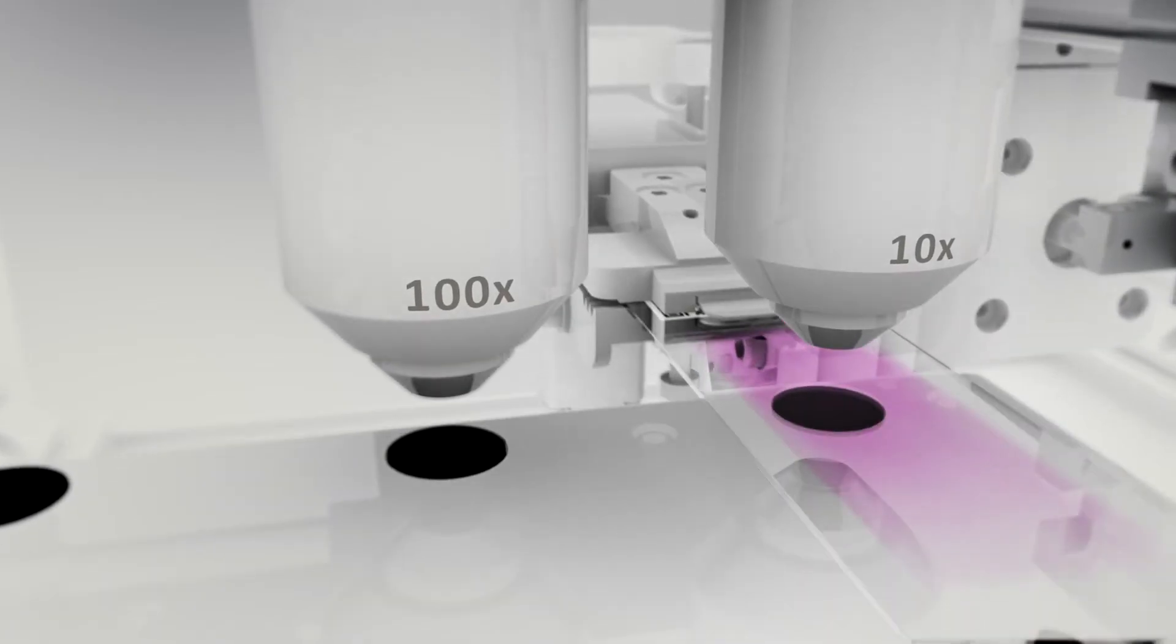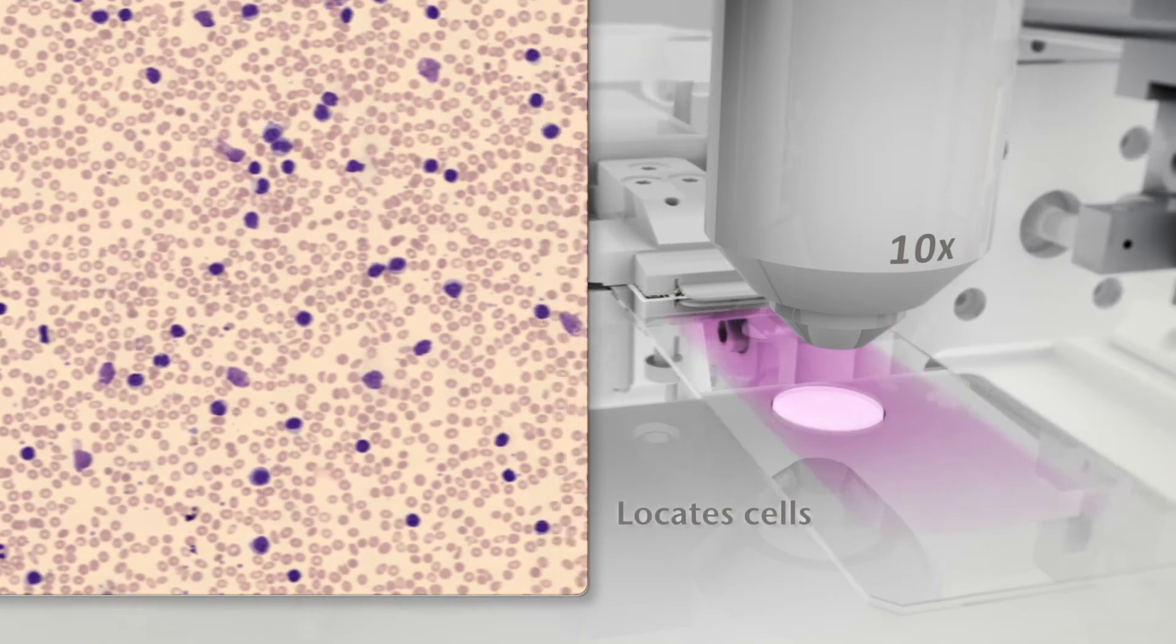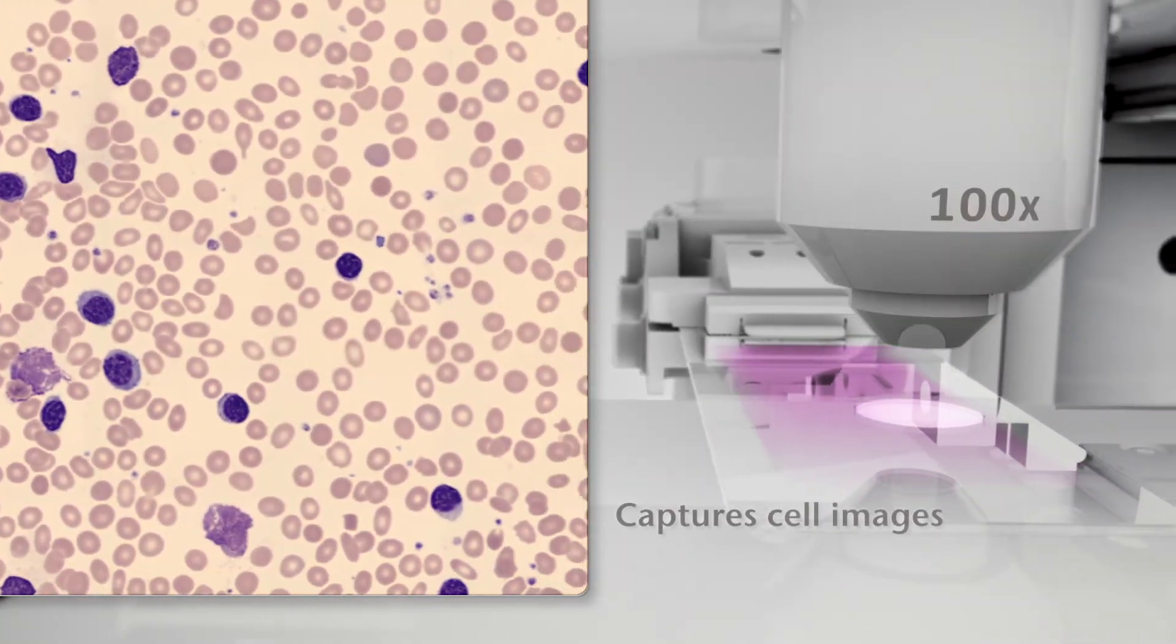The slide is automatically positioned under the microscope and the monolayer is identified. Cells are located and high-quality cell images captured.